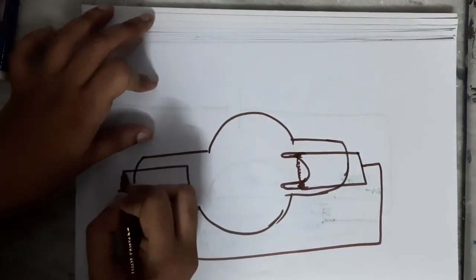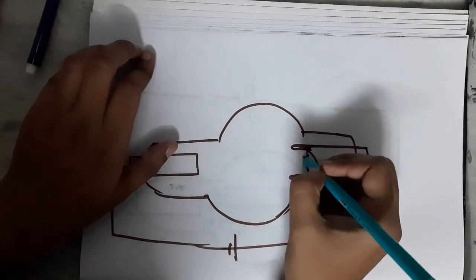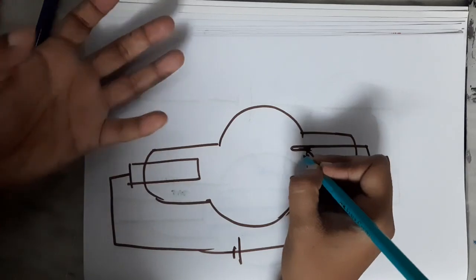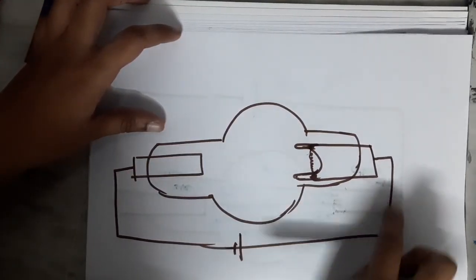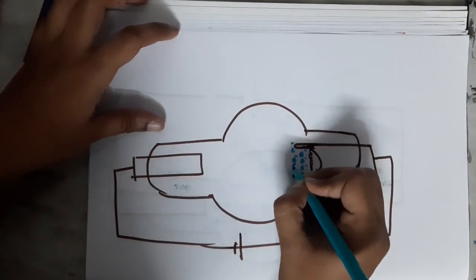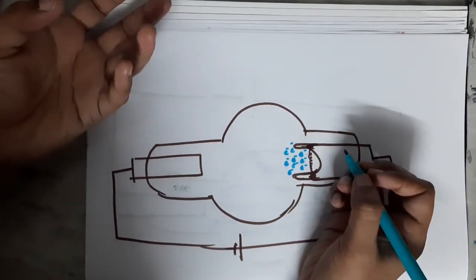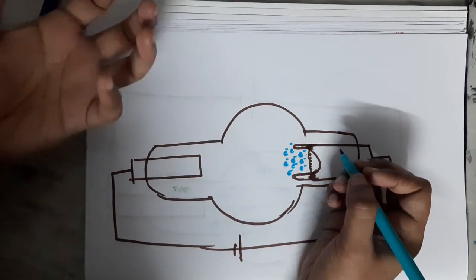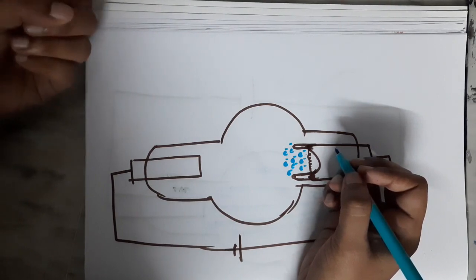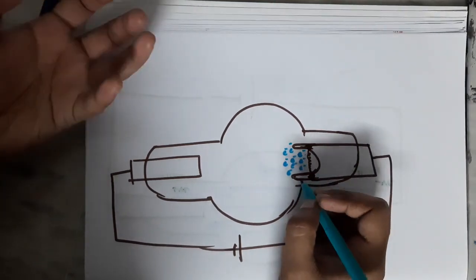And this is the anode. We will learn about the anode in our next class. And current is applied. Now, if you see, this is the tungsten filament. When the current passes, some of the electrons will acquire energy to leave their atom. Once they acquire thermal energy to leave their atom, and come out of their orbital, the emission of electrons is called the thermionic effect.